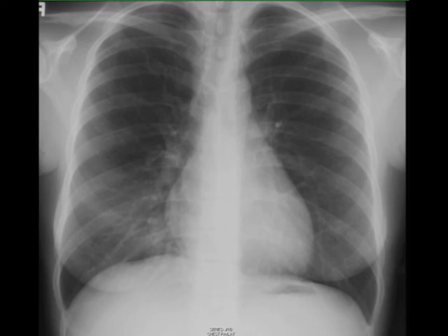This is a chest PA and lateral in a patient. You can see the lungs are well inflated, the costophrenic angles look good, and the heart size is normal.